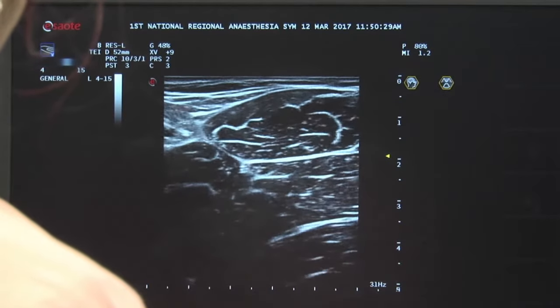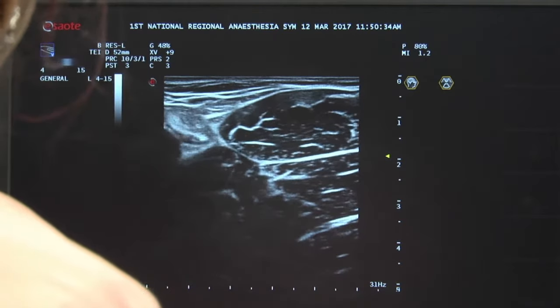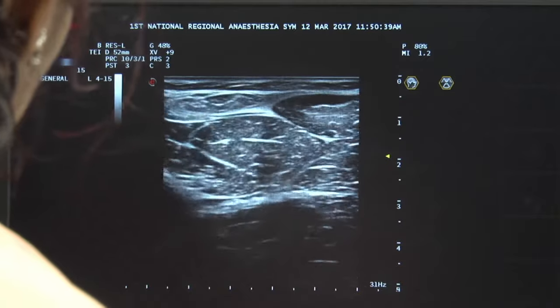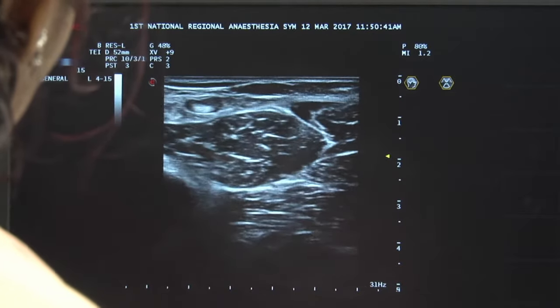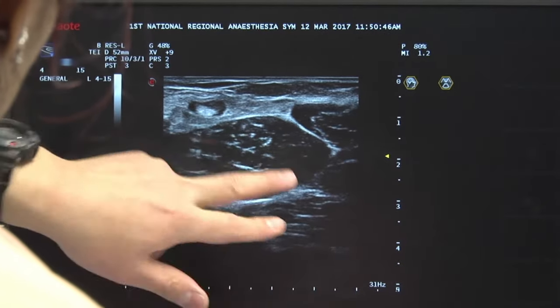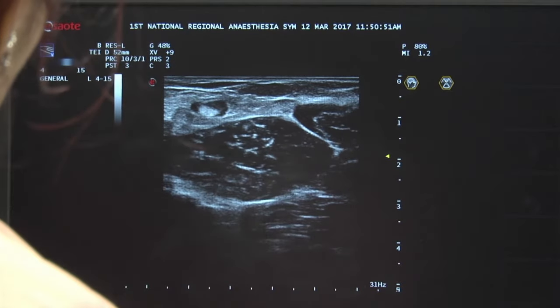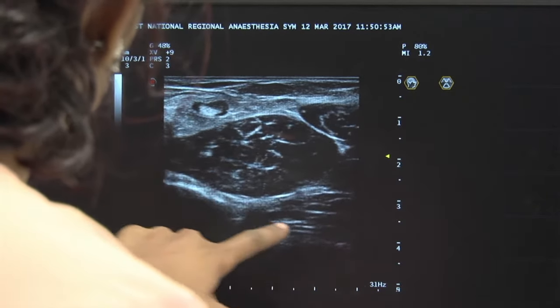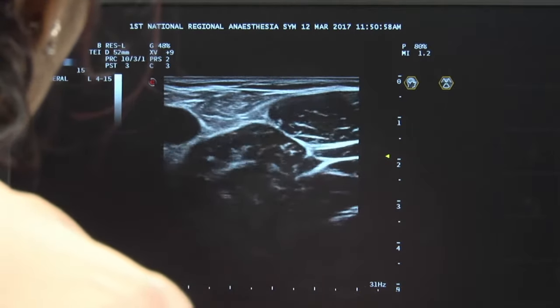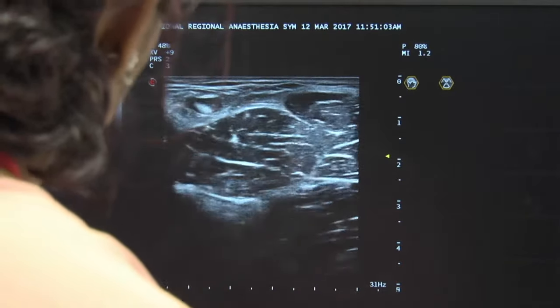If I wanted to give the posterior branch, you mean proximal? So you should tilt the transducer cranially, like this. So you can see another plane here, the plane between pectineus and obturator externus. So basically, I just go and find the three muscles, and then go medially until I find the three muscles, and then I tilt it. Yeah, right.